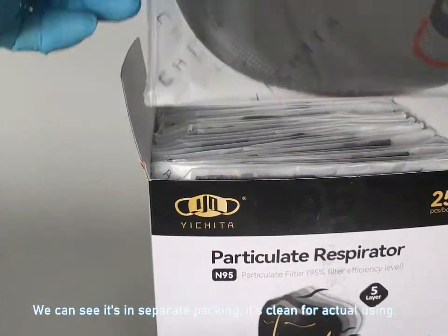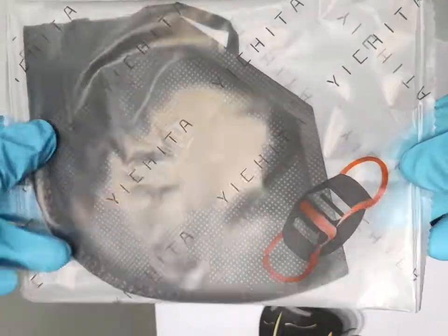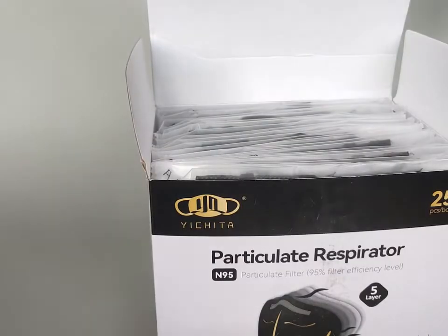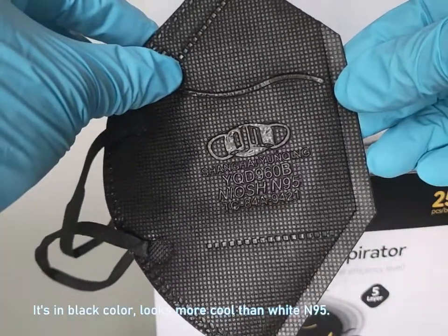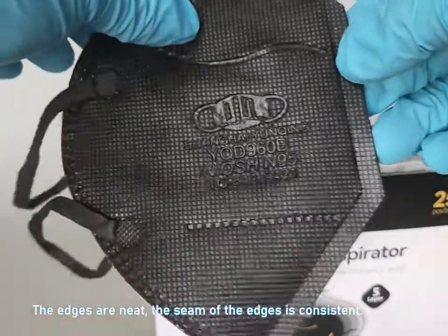We can see it's in separate packing, it's clean for actual using. It's in black color, looks more cool than white N95. The edges are neat, and the seam of the edges is consistent.